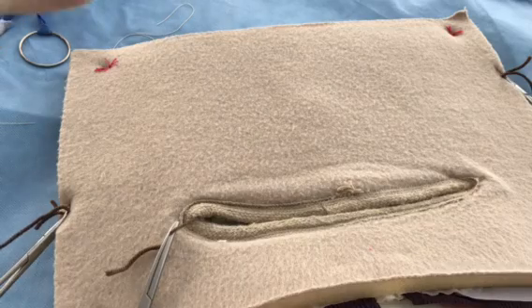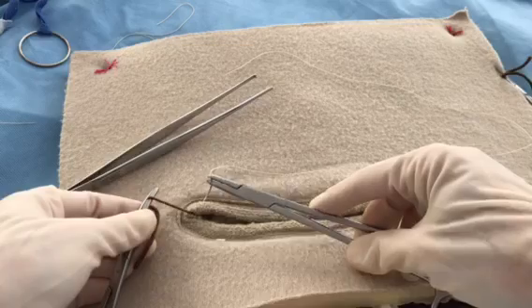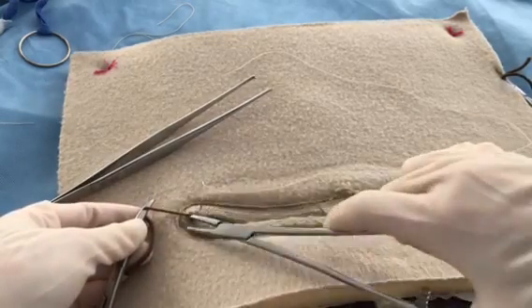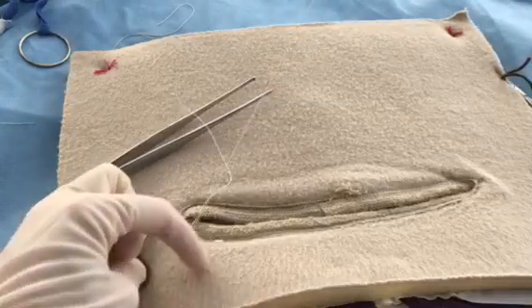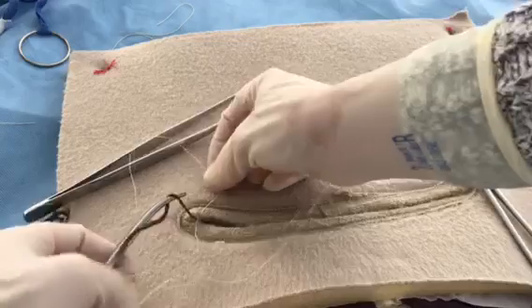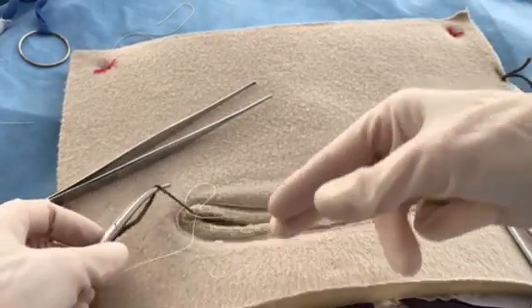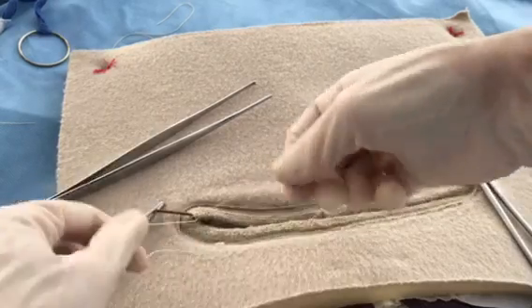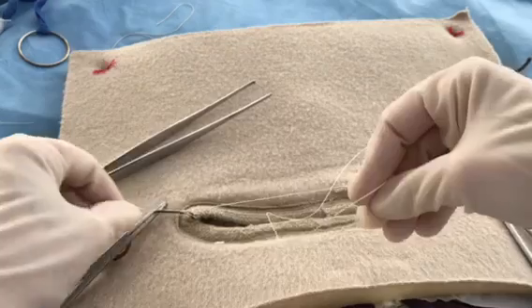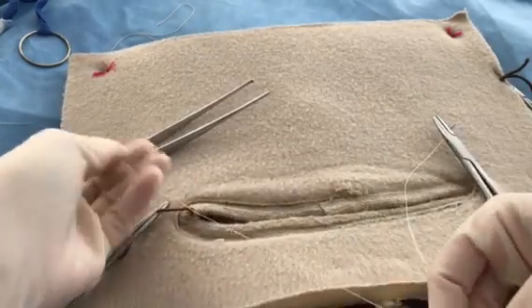This is used most often for vessels that are critical, such as a uterine artery. The suture is anchored in the tissue and it is passed around the vessel, and a one or two handed tie is performed.